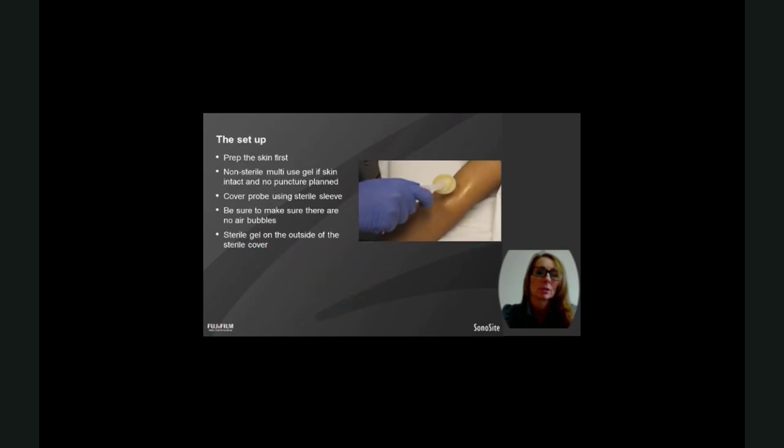So when you're setting up to do your scanning, I think in the dialysis unit it's probably best to just always cover your probe. If we're scanning fistulas, even though they may not have been punctured today, they've got scabs on them and they've got healing puncture sites. So it's just best to cover your probe, and that way you're not risking contaminating your probe and then someone may be picking it up and using it on someone else with a bit of debris or something on it. We definitely should be cleaning between anyway. But I like to cover the probe whenever I'm using it on a patient.